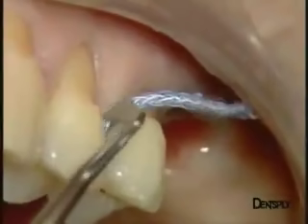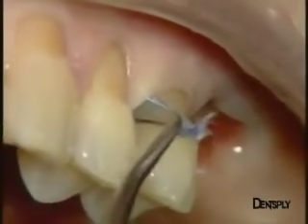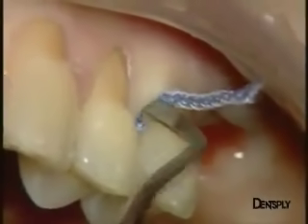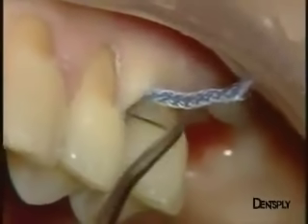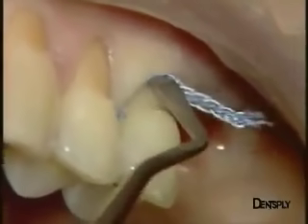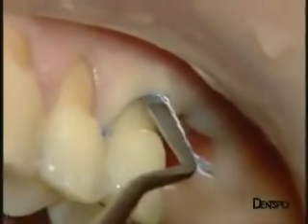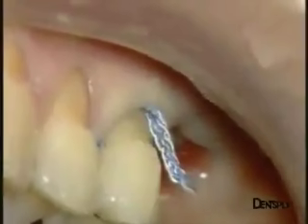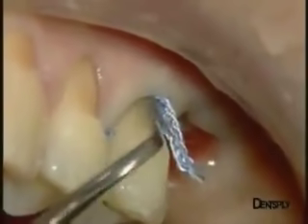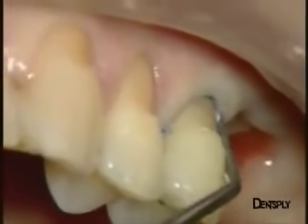To complete these 3 fillings, we chose not to use a rubber dam but instead use a retraction cord that is inserted around each preparation, so that we avoid any leakage of gingival fluid. It will also prevent the adhesive from going into the sulcus. The cord is not impregnated to avoid any interaction with the adhesive materials and is simply inserted into the labial margin.